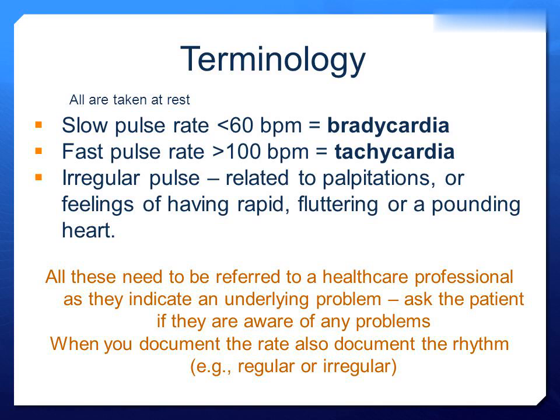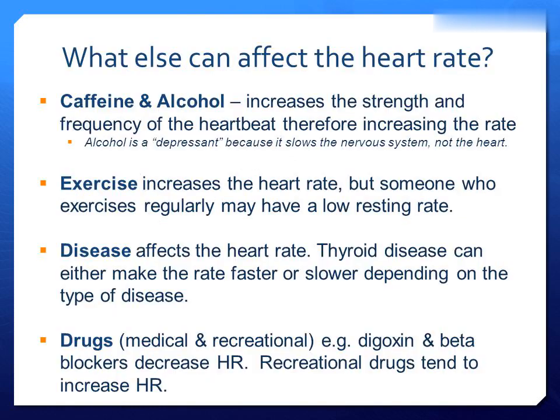All these need to be referred to a healthcare professional as they indicate an underlying problem. Ask the patient if they are aware of any problems. When you document the rate, also document the rhythm, for example, regular or irregular. What else can affect the heart rate?